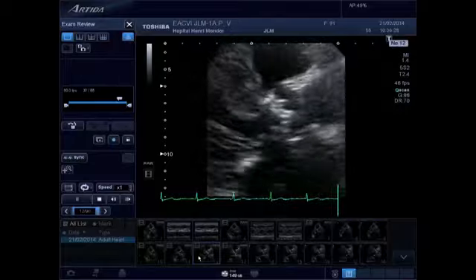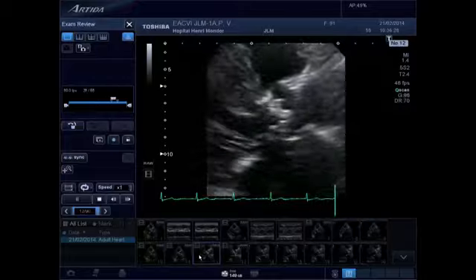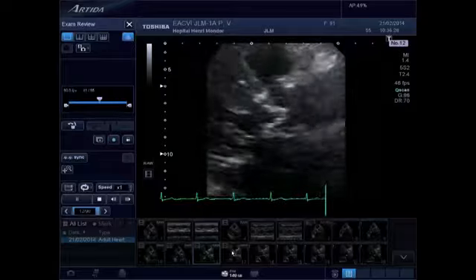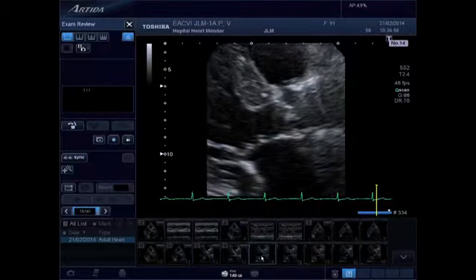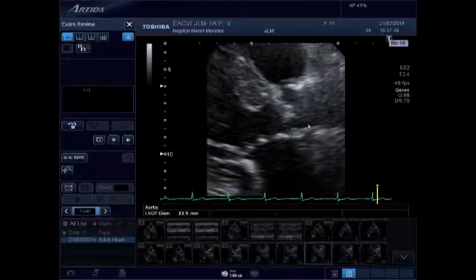It's better to say that we will measure the virtual basal ring of the aortic valve, and the measurement is opposed to the technique that we used formerly to measure the aortic root. In this case, we will measure in systole with the valve opened, and we will measure from inner edge to inner edge and parallel to the plane of the valve.